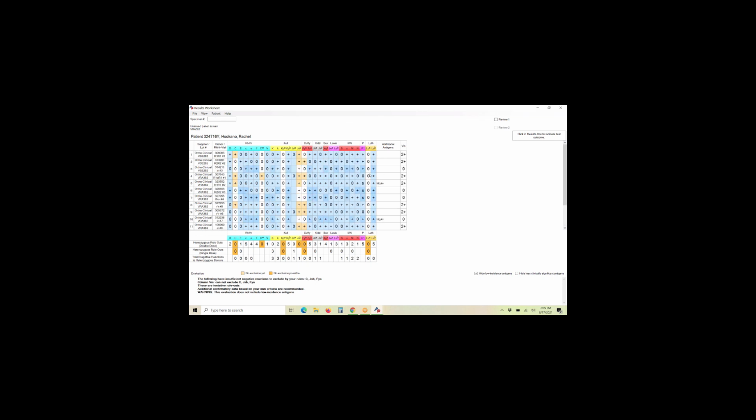You can see Lutheran A, there's not even a Lutheran A cell in the panel, and same with KPA. In this case, there's not one. There is one CW, but there's other orange antigens highlighted that there could be an antibody against. So we're not really going to have them high on our list of priorities right now. So that leaves us with C, JSB, and Duffy A, which is what's listed here. And it's also listed on Vision right below because that's the only thing we've tested so far.